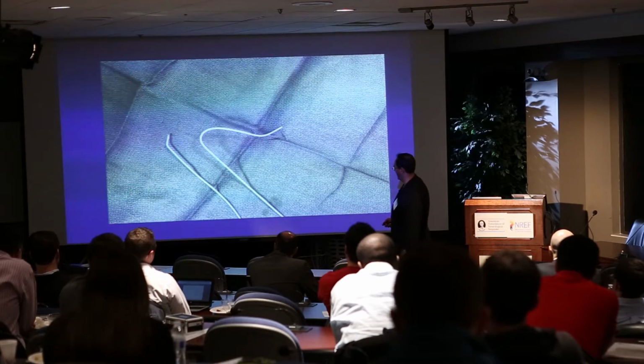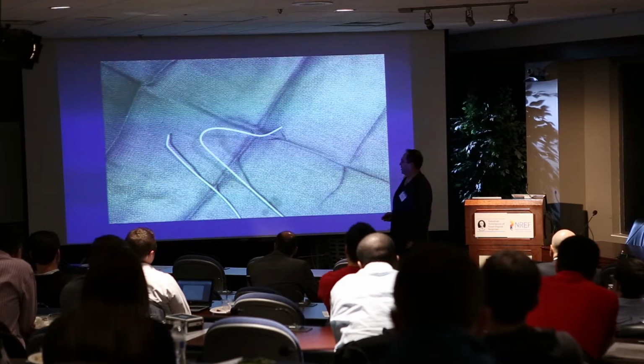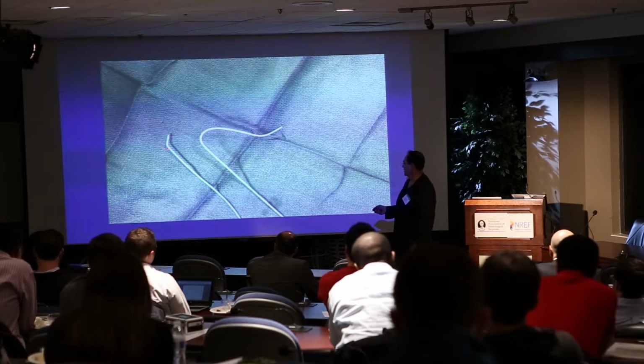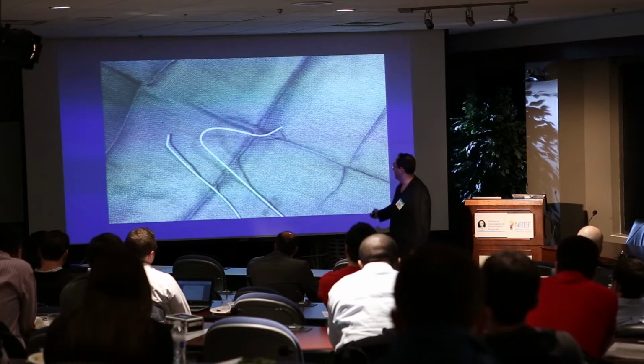And there's a picture of them from our case yesterday, taken by Omar. So here the Tempo Vert, 5 French with the slight sort of hockey stick, and then the Simmons that we needed for the left carotid in our case.